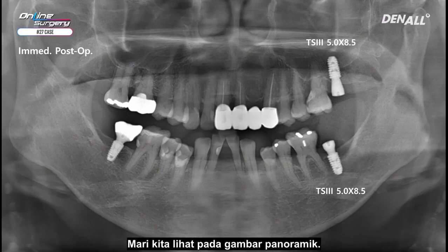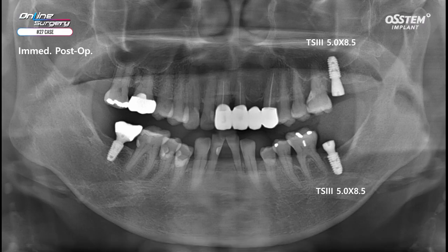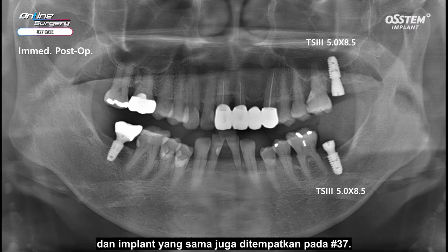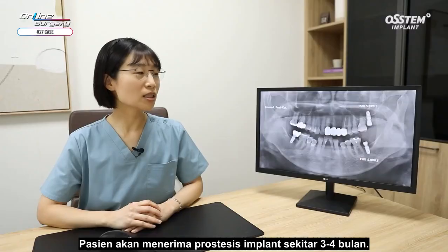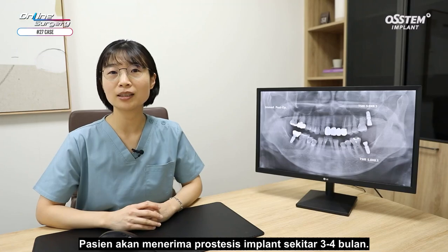Let's look at the panoramic images. As planned, in number 27, TS3 5.0 by 8.5 was placed, and the same implant was placed in number 37 as well. The patient will receive implant prosthesis in about 3 to 4 months.